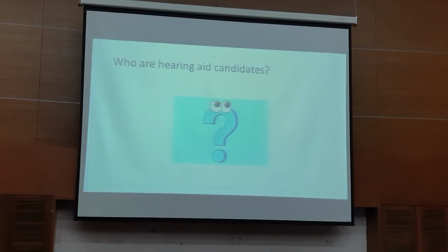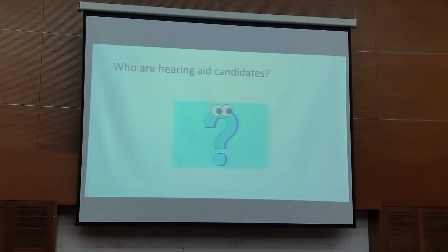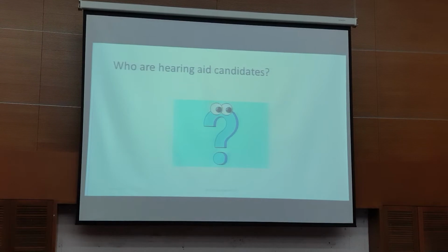Who are the hearing aid candidates? In general? Alright, the answer here was, in general, anyone with hearing loss, right? In general. Alright.